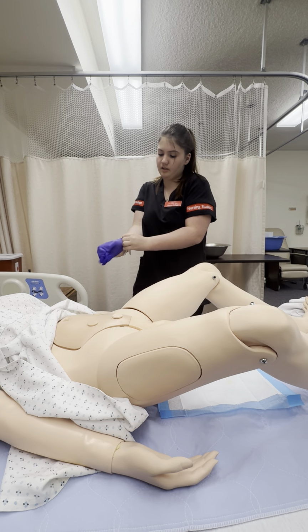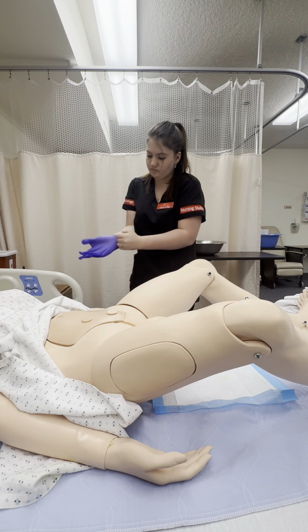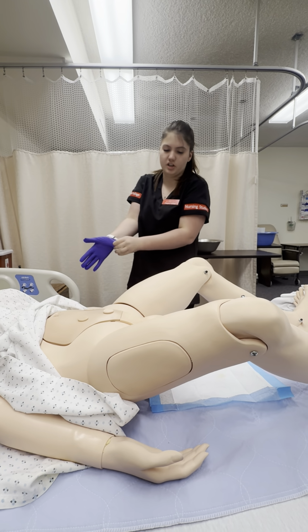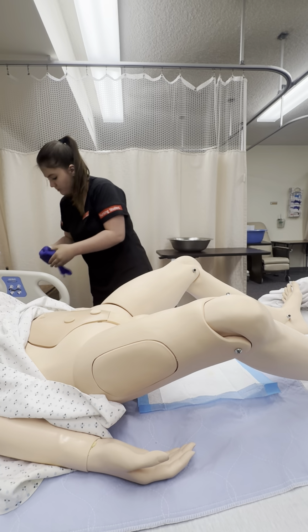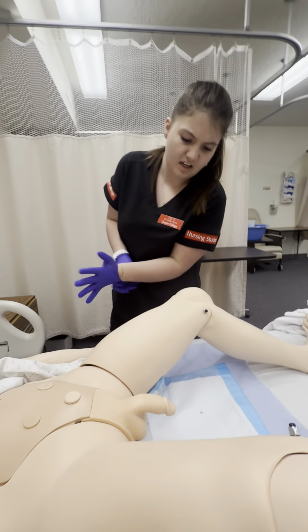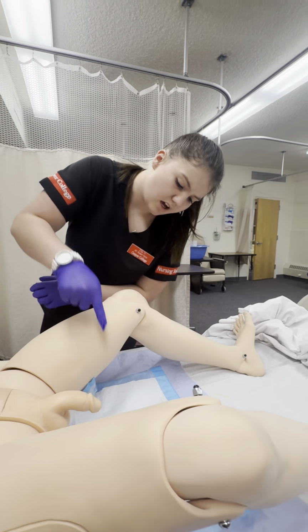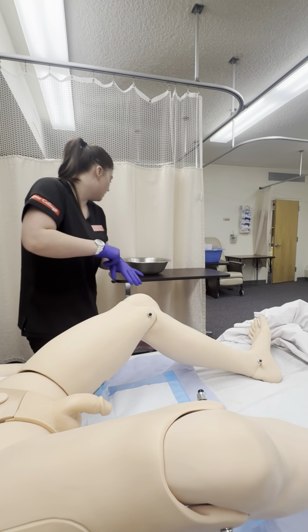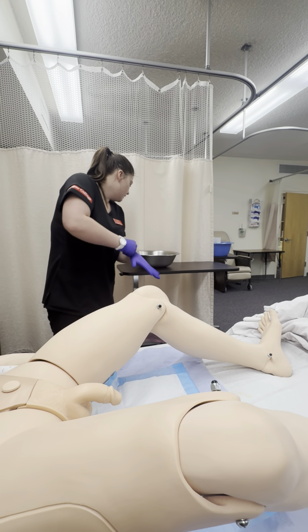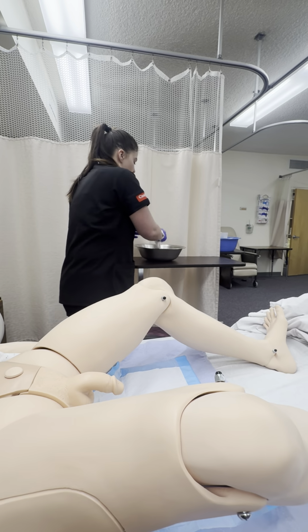Now that I've taken out the tube, I'm also gonna once again note the genital region. Just do a slight integumentary assessment. After taking it out, I'm not seeing any pus or any external signs of infection, no blood or mucus coming out of the tip, so we should be all good.